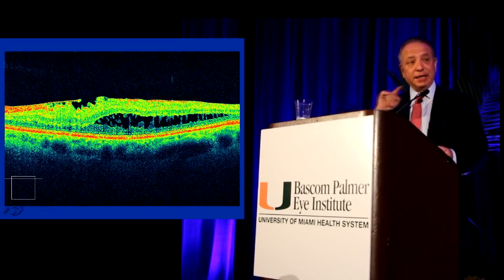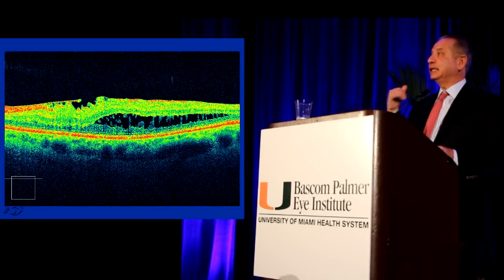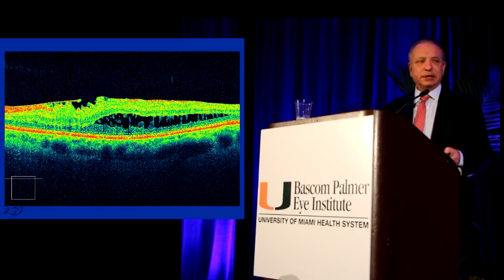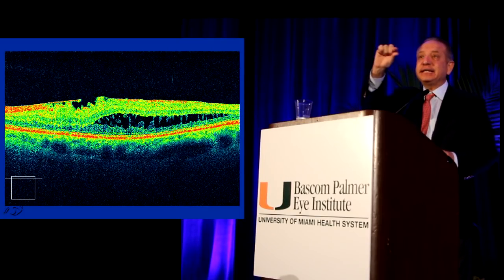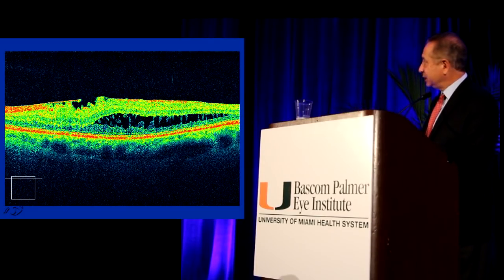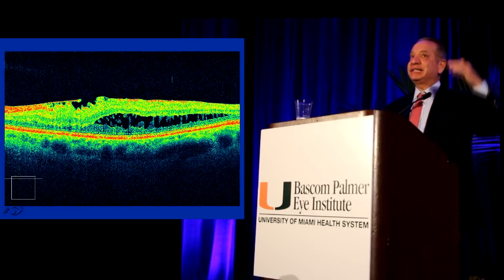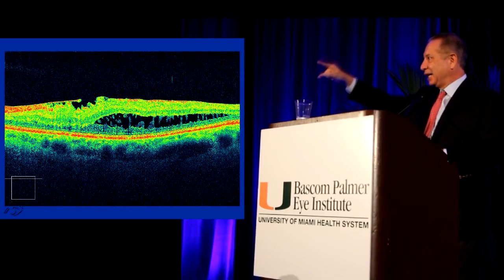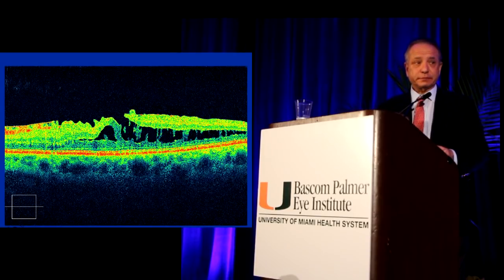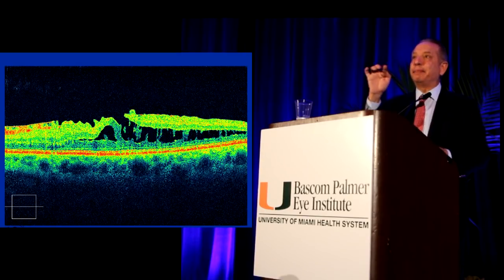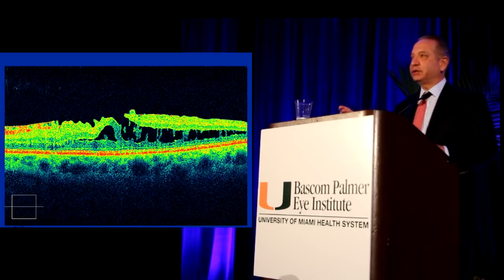This is the left eye thickness map. Looking at the five sections on the Zeiss Cirrus machine: I see an epiretinal membrane, cystic spaces in the inner retina, but also something else — the outer retina is intact, and the ISOS junction is intact, which is consistent with having 20/30 vision. Good vision comes from the outer retina. Going further down, we see more cysts. At the center of the fovea, we can see that this patient has a lamellar or partial-thickness macular hole with preservation of the outer retina and good vision.